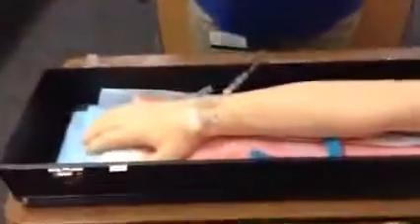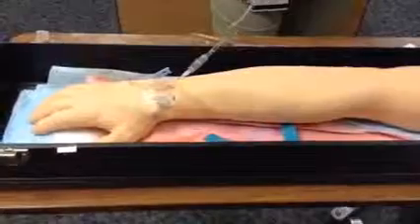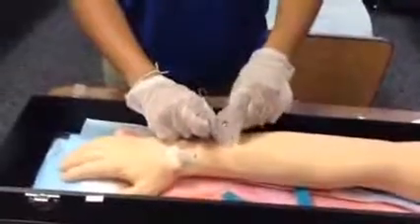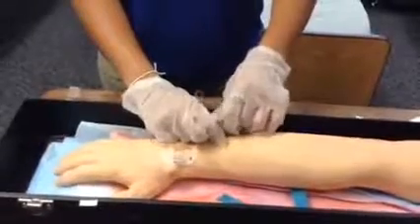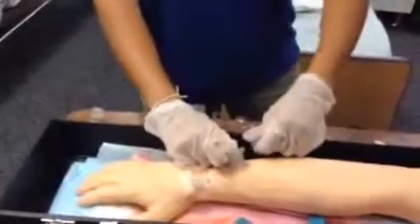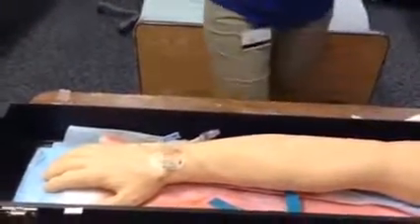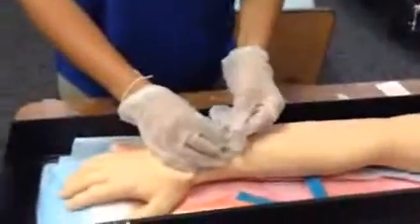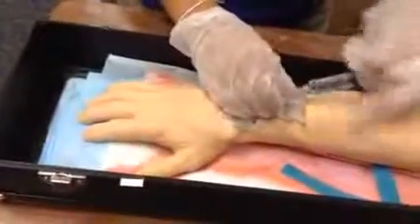Alright. Now we're going to make sure we close this off. And we're going to check for phlebitis or infiltration. And there is no phlebitis or infiltration. We're going to clean the port with alcohol again, and attach the syringe one more time.